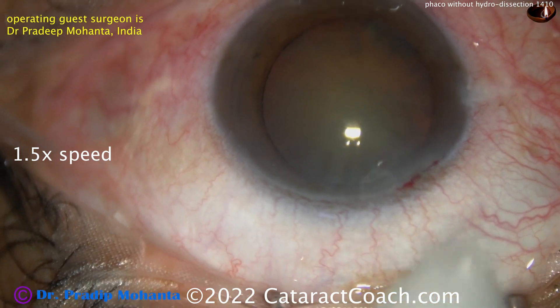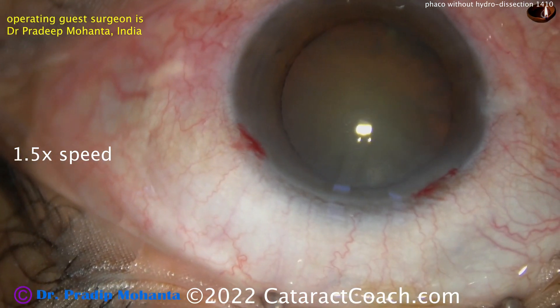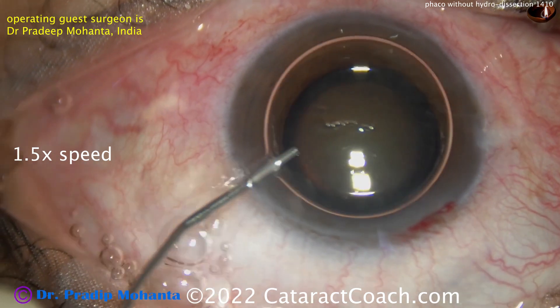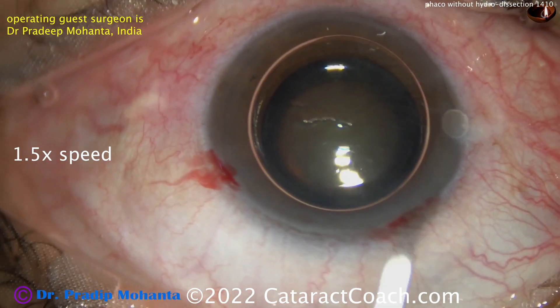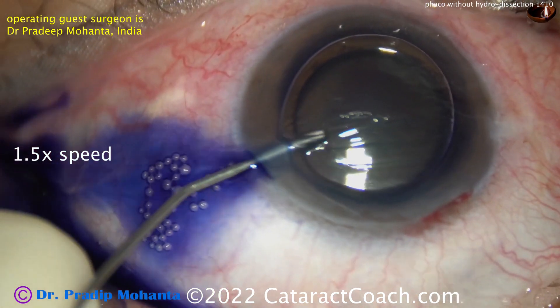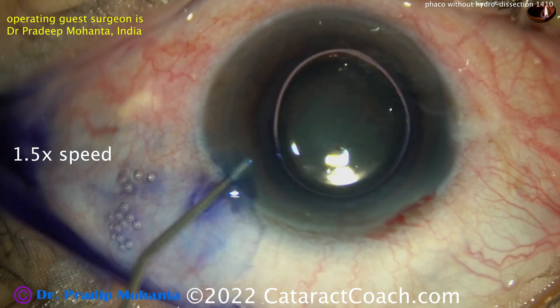There are certain cases where you want to avoid hydrodissection. Think about a posterior polar cataract, or a patient who has had a prior intravitreal injection where you suspect the posterior capsule may be damaged. What if there is very weak zonular support and you don't want to put any stress? There are a lot of options here, so let's learn these techniques.